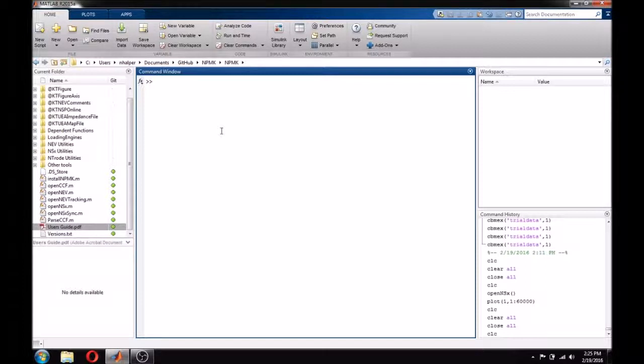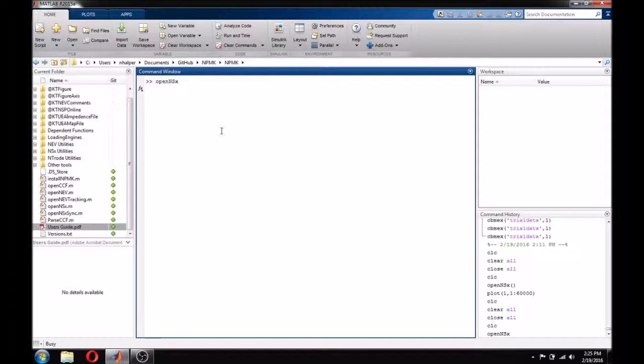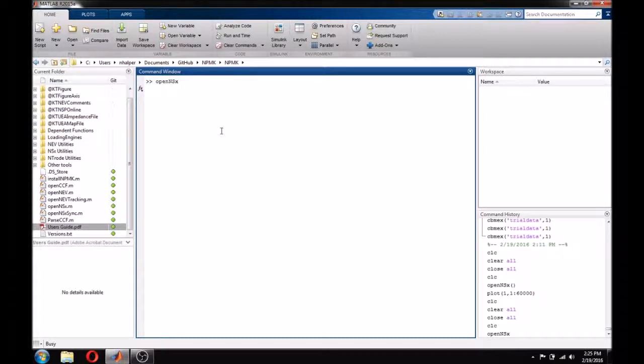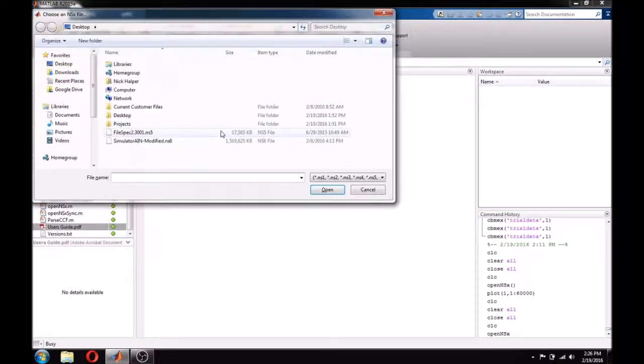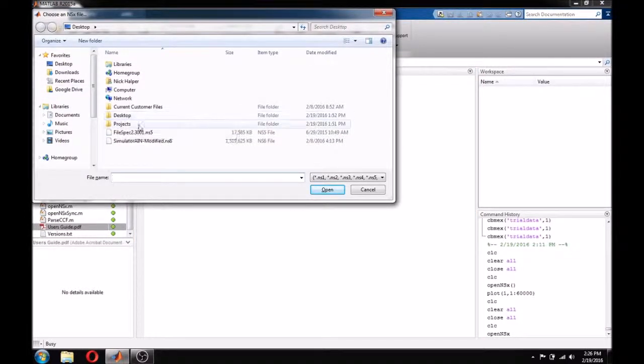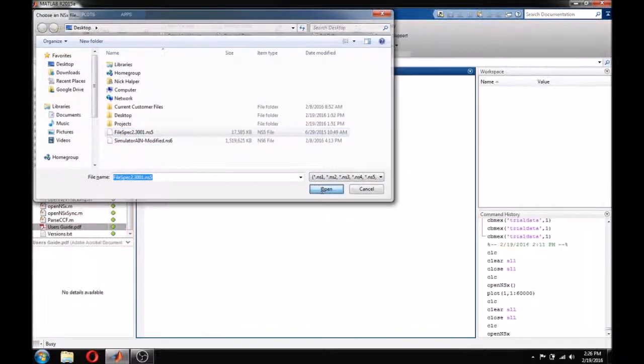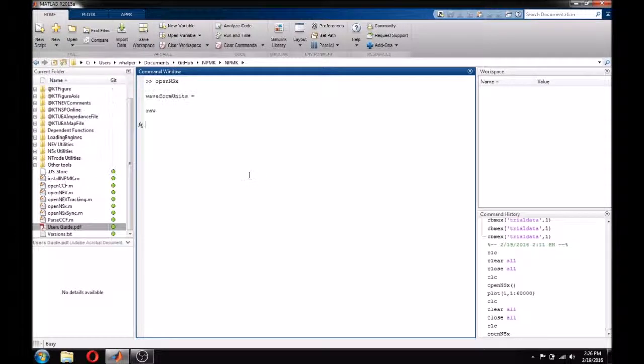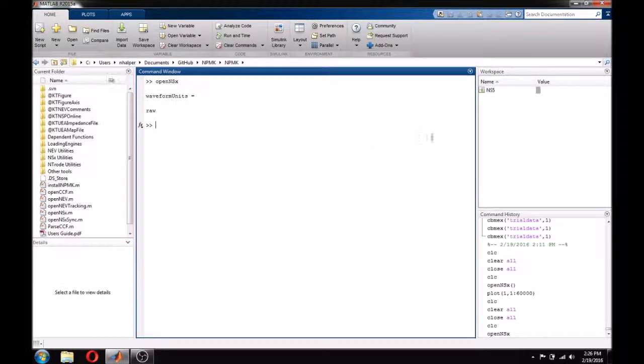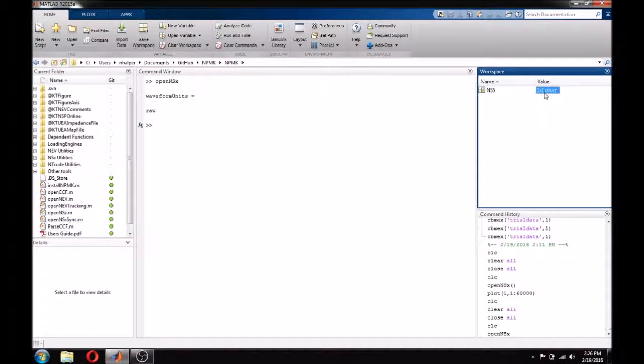To open a NSX file, simply type OpenNSX. This will open a file dialog for you to open your NSX file. I am going to choose, from here, some of the sample data that is available on our website. After selecting the file, NPMK will quickly create a structure that contains a few pieces of information.